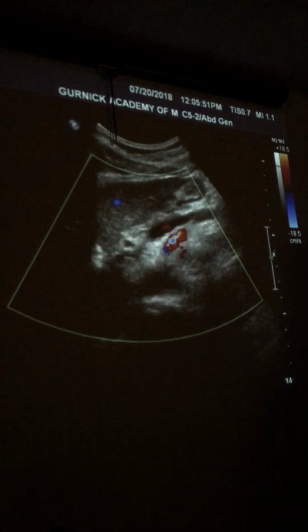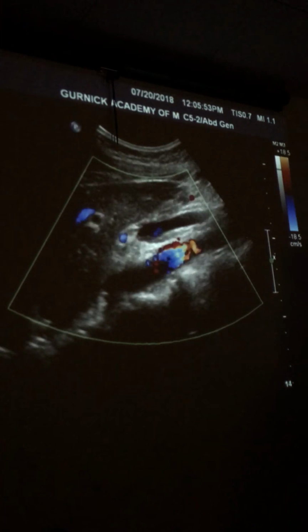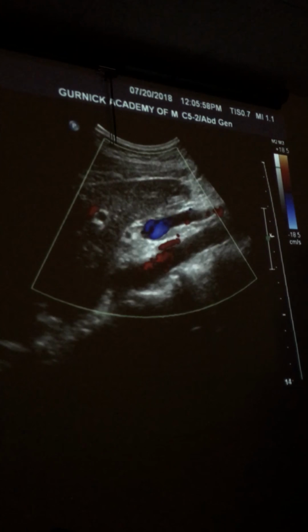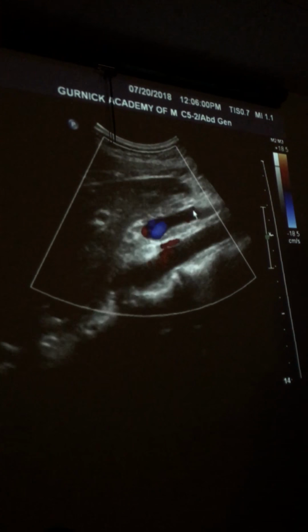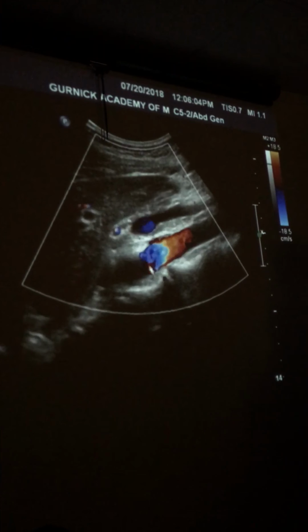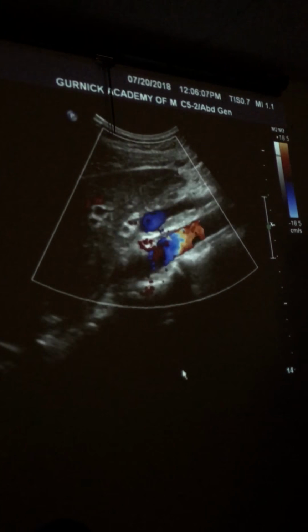I'm going to turn long on it. Now what's it going to do? So now my portal vein confluence is right here, right? The confluence going towards the spleen. My SMV is going to come up this direction. Remember, it's coming up from below.